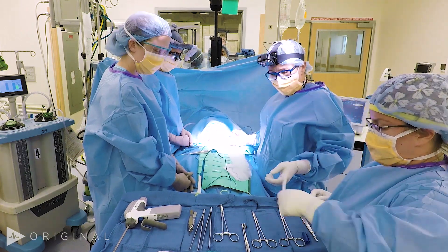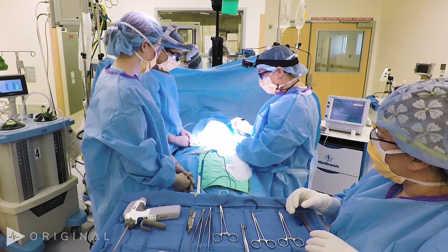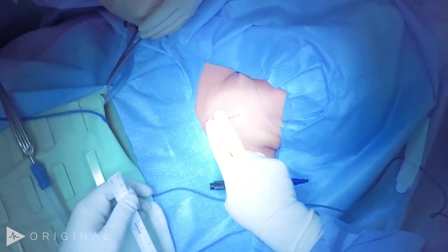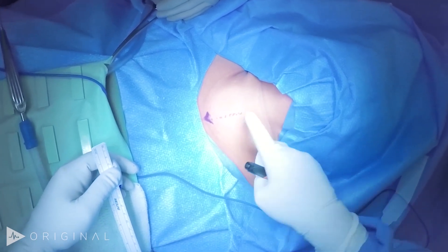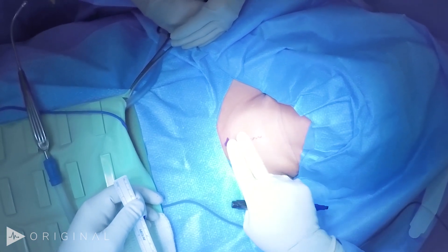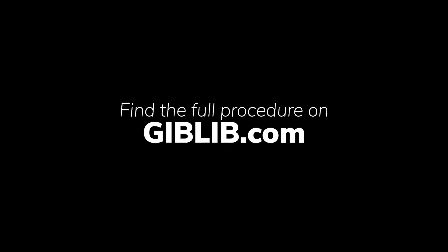This patient has a small lesion in the right lobe and a normal sized thyroid, so we're going to begin with about a little over a four centimeter incision. You want to be two finger-breadths above the sternal notch. She has a nice crease here which we like to use, but this is too far up — if we use that incision we won't be able to reach the inferior poles of the thyroid. So we're going to split the difference between the sternal notch and that crease, which will be about here.